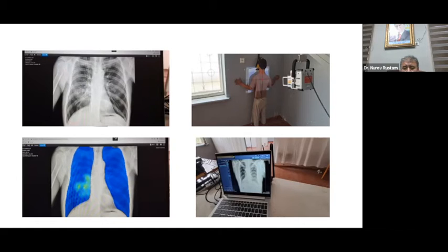And as a concluding remark, I would like to especially note that these portable X-ray devices are especially efficient to use in remote areas, mountainous areas, and rural areas. Especially for mountainous regions, you can use them with no issue.